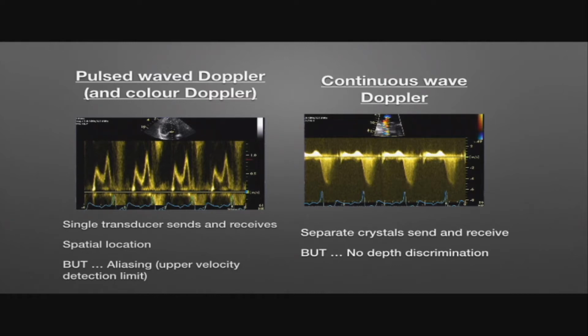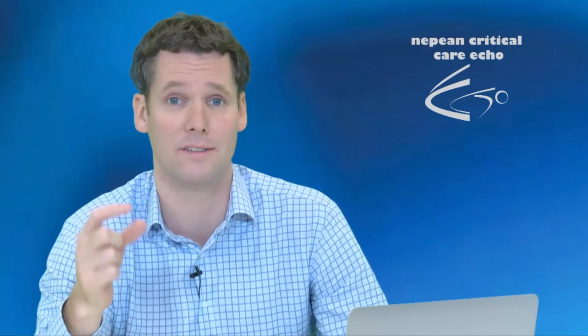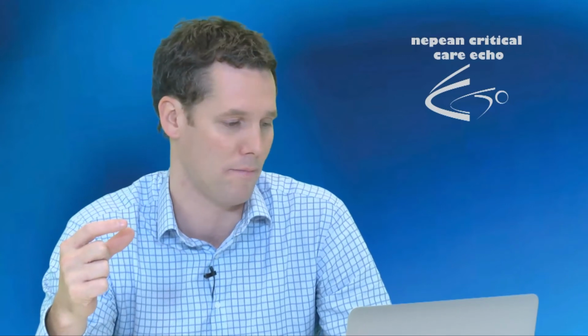And what pulse wave Doppler is all about is this gate that you're putting. So you put a gate at a certain area, and if you can just make out on the image there, it's at the inflow to the left ventricle. So you're asking the computer to just tell you about the movement of the blood, or it could be tissue as well, but just in that certain portion of what you're looking at, hence the pulsed wave Doppler, and you're just looking at the gate. So you're getting some spatial location. That's the advantage of this imaging modality, that you're actually just looking at a particular space in time.